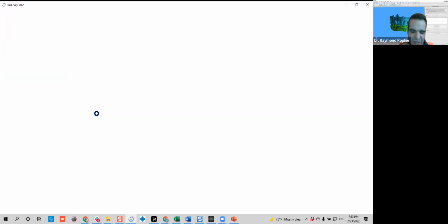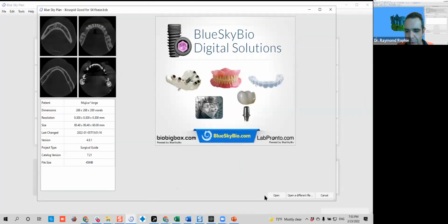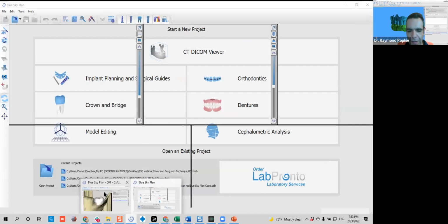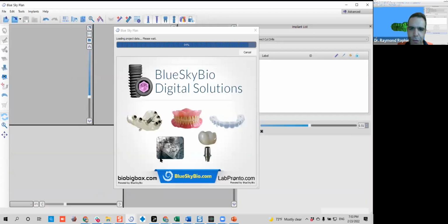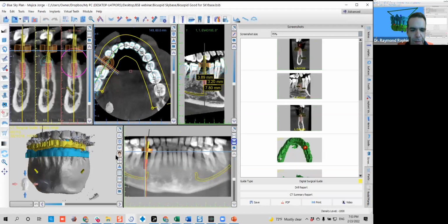It's still okay. Let me quickly get to the point where we are in this case. This shouldn't be happening. This is not normal. Definitely, I don't think this will be happening to you or me once we finish the webinar. Anyway, let me get to this area real quick.